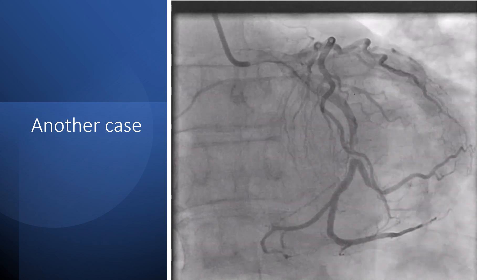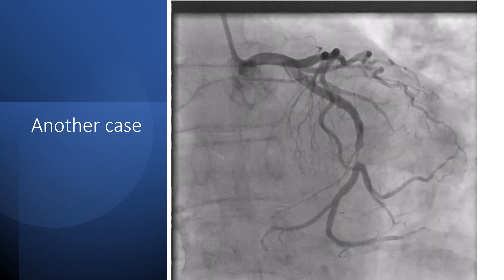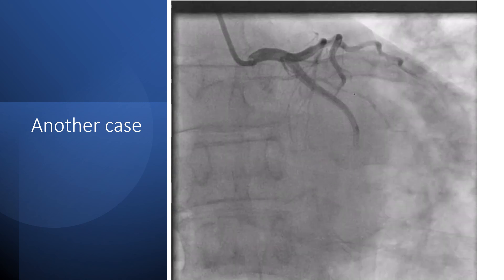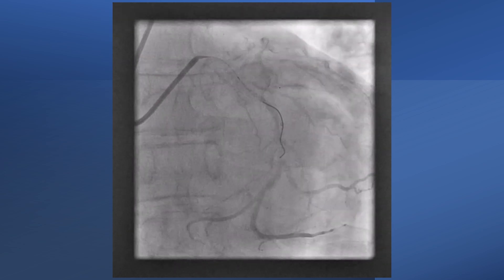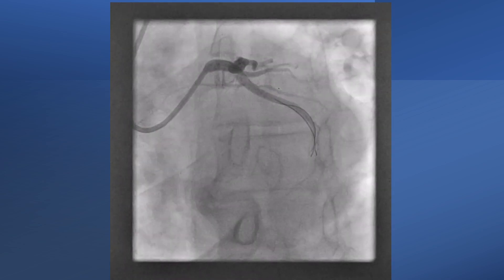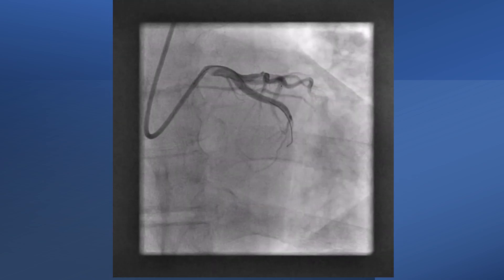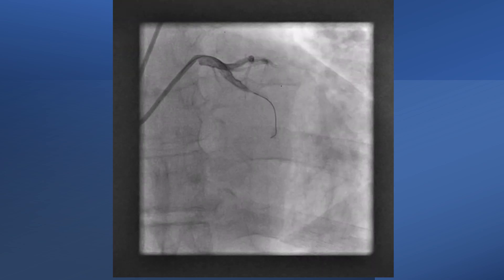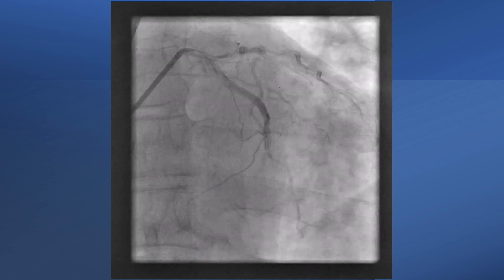In another patient with unstable angina found to have dominant circumflex with subtotal occlusion — it looks like a piece of cake lesion. The first wire, which was a BMW wire, was stuck at the lesion and the true lumen could not be negotiated. The first wire was left in place and a Pilot 50 wire was used with different tip curves and different coronary angiographic views. We noticed that we were only increasing the dissection. Some staining appeared before the bifurcation.